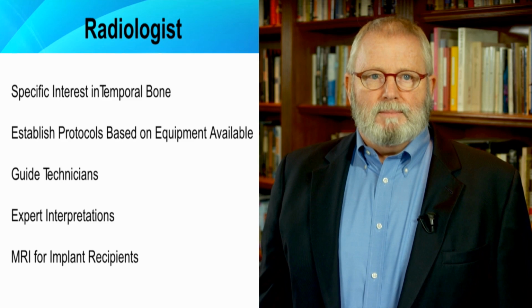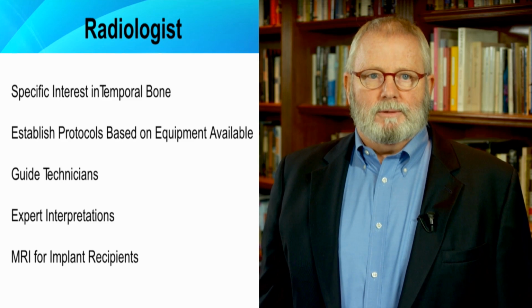Some centers use primarily MRI for evaluating cochlear implant candidates. Other centers use primarily CT, and some centers routinely use both. Individual centers should work out with their radiologist which techniques to utilize. And finally, some experienced temporal bone radiologists are willing to perform an MRI in an implanted patient without removing the magnet from the stimulator receiver.